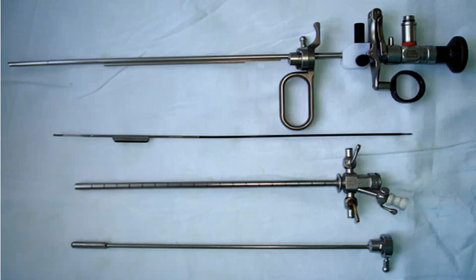So now tell me, for visual internal urethrotomy, which telescope will you use? And now describe the procedure. How will you do it? A 0-degree telescope will be used, sir, for VIU.